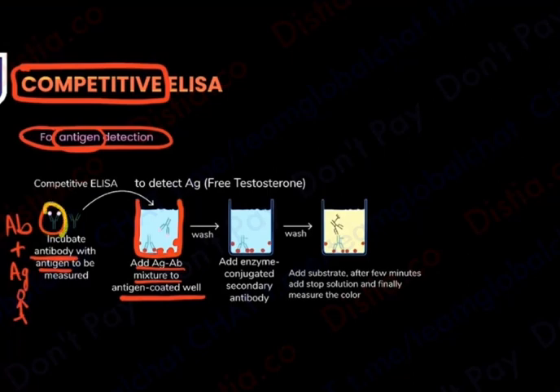So if the antigen-antibody reaction as a competition has occurred outside, when it comes inside this well, it will keep floating like this. It will try to show chill, I'm floating around. I'm not going to show this reaction. Now when you do that test of yours, that is, you add the secondary antibody and the enzyme and the color, all of that.